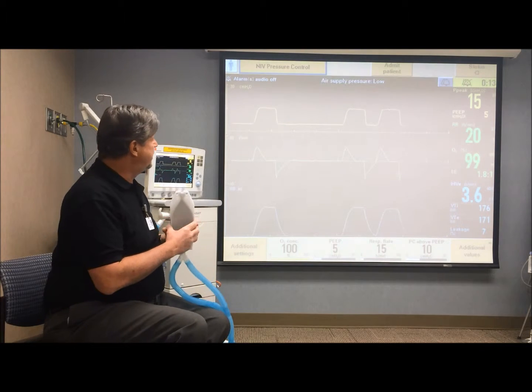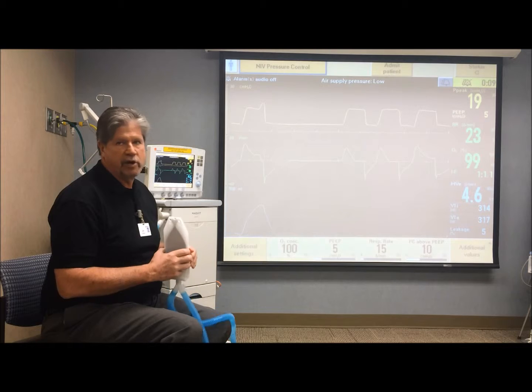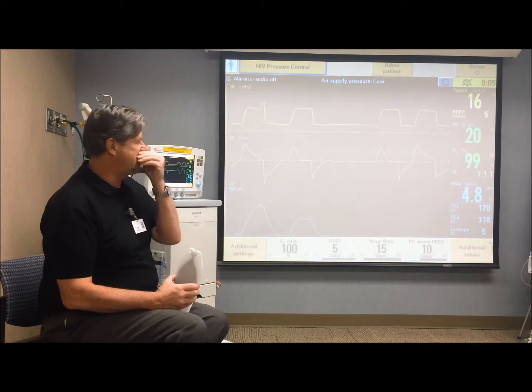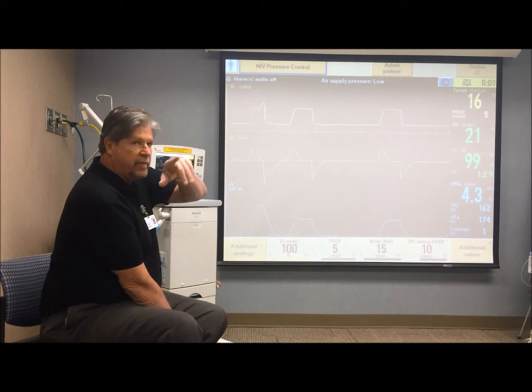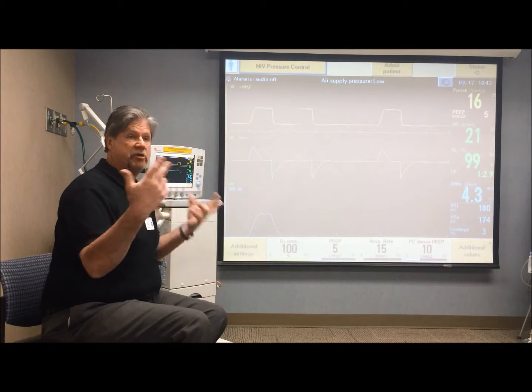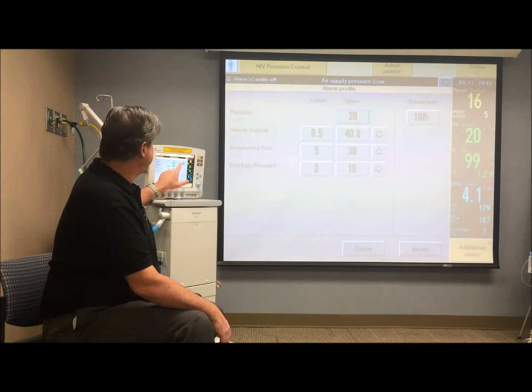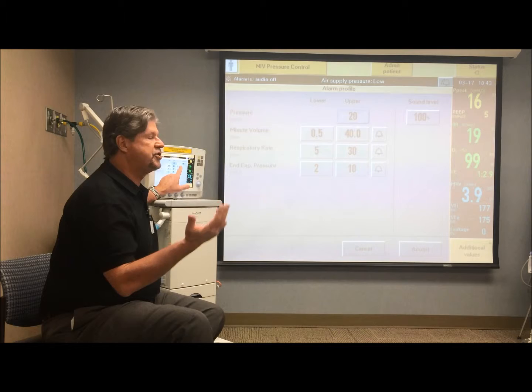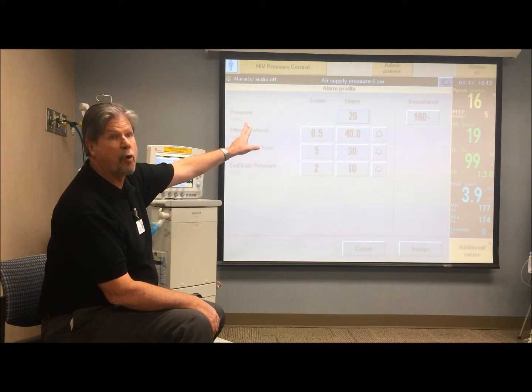So now, in this case, if he's triggering the ventilator, he will trigger just like pressure control if you have a good seal and everything is reasonable with his seal. Now, one of the things that you mentioned early on about adjusting your settings initially is the fact that in non-invasive, the default parameter for the upper pressure limit is 20. And everybody is used to mostly invasive ventilation where the upper pressure limit default is 40.